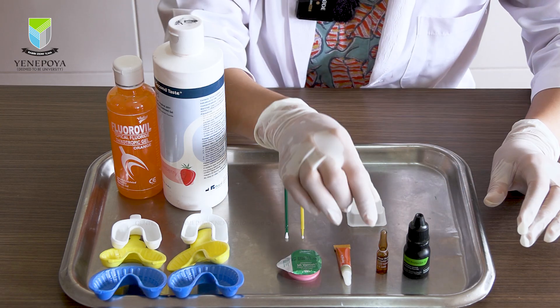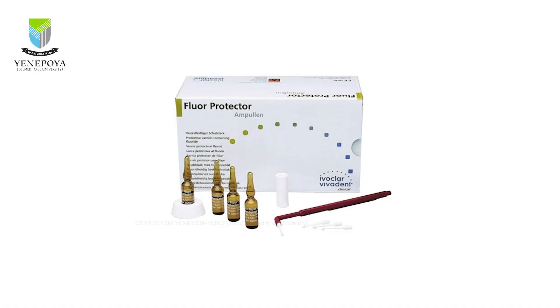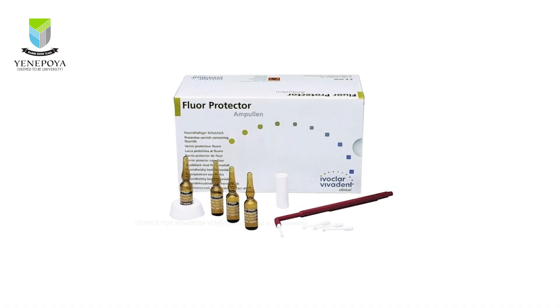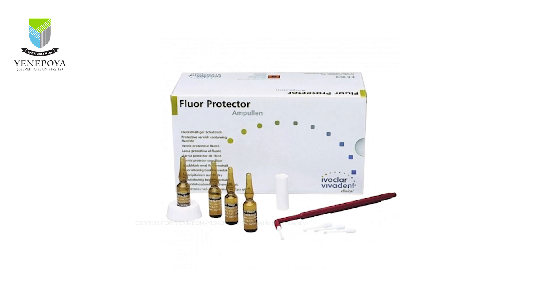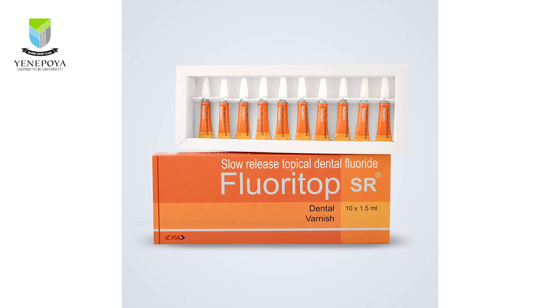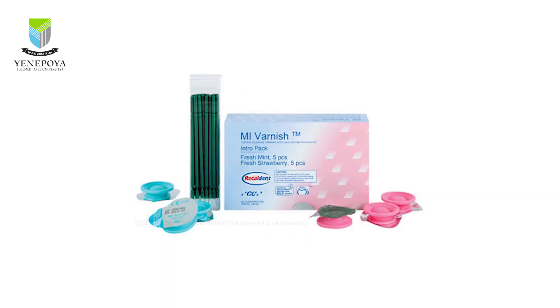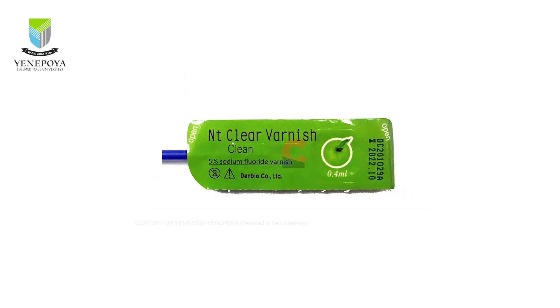Thus a pre-packed unit dose of the same is also available in a vial like this. The unit doses are more practical to use to avoid wastage of material. Then we have three options for sodium fluoride varnishes: floretop SR, MI varnish, and NT clear varnish.